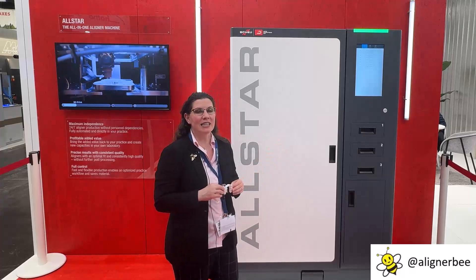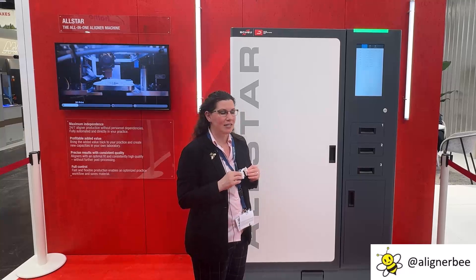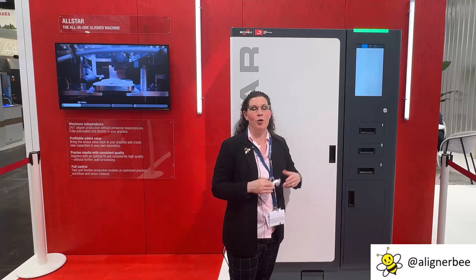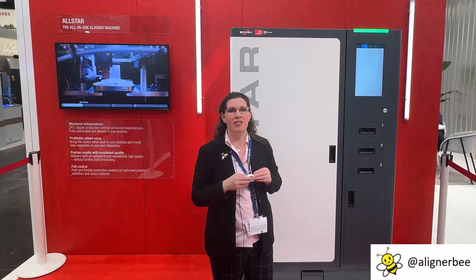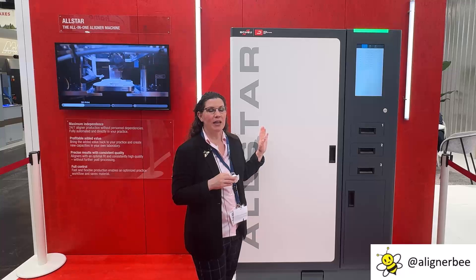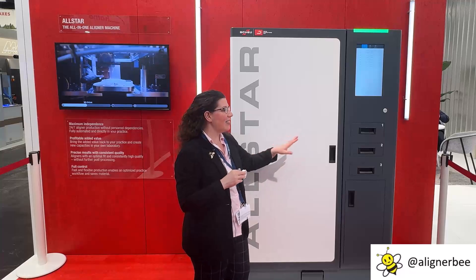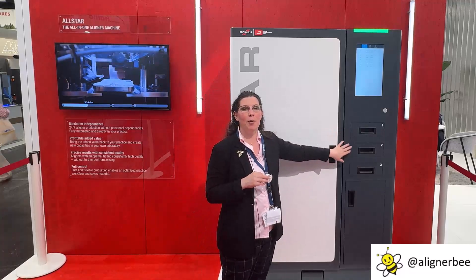When we look at this system, there are a lot of really interesting components. The lower area contains an area that will hold your thermoforms, and you can choose up to four different materials. The 3D printing process, thermoforming, and vacuum forming happen in the main unit in addition to the laser trimming, and then the aligners are sorted per patient.